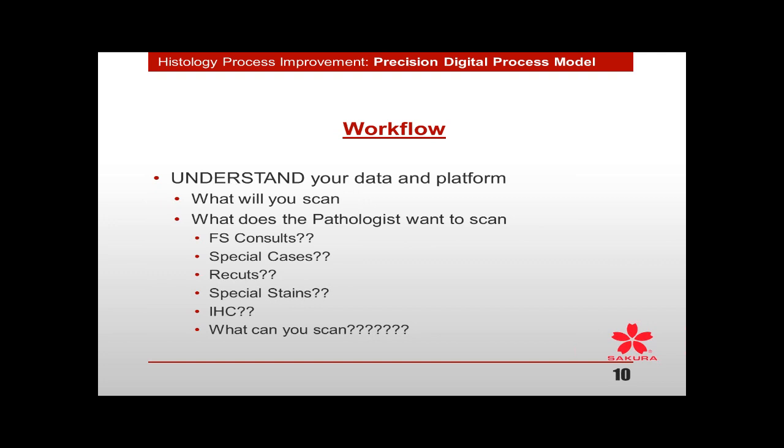And we won't get too deep into this because there are so many different LISs out there, but some of the simple stuff is, you've got to sit down and talk about it before you buy the scanner. What will you scan? What does the pathologist want to scan? Is it frozen section consults? Is it special cases that they want to scan? Recuts, special stains, IHCs, tumor board, education, consults, outside consults.